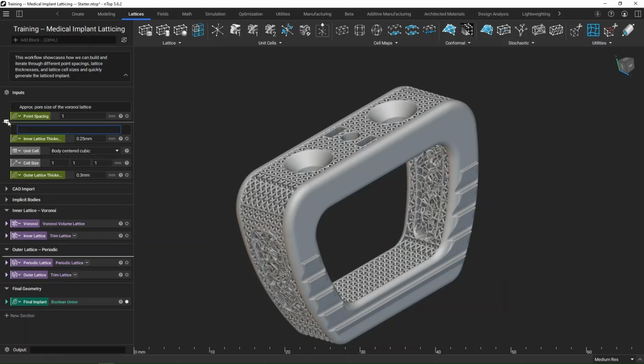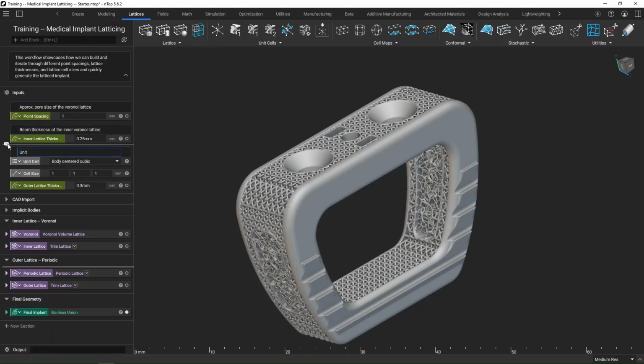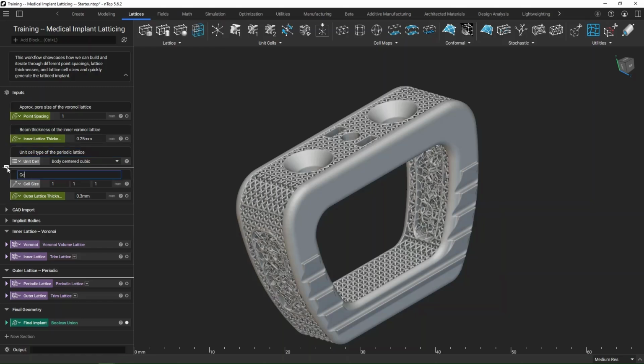I could go ahead and also add comments by clicking on this little comment speech bubble, just to have more clarification over what each of these are doing. So this is going to be the beam thickness of the inner Voronoi lattice. This is going to be the unit cell type of the periodic lattice. Cell size of the periodic lattice.